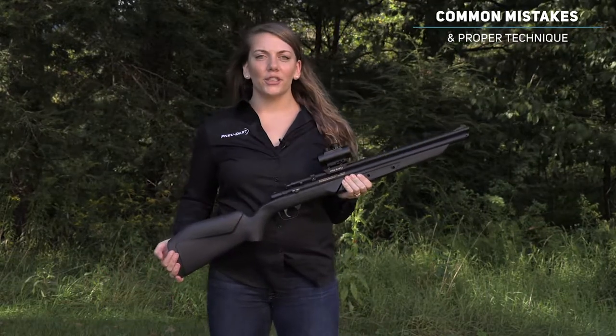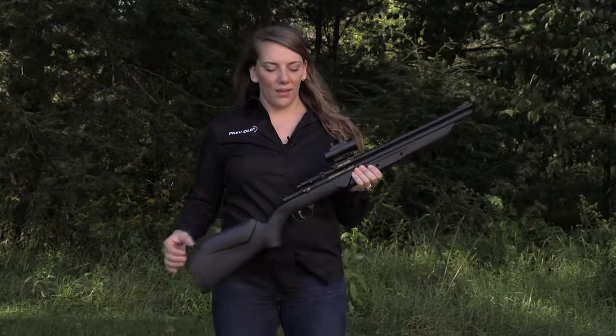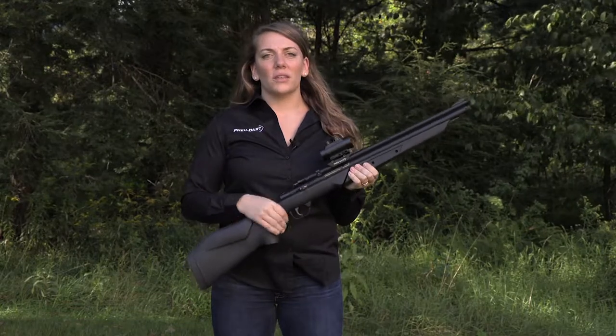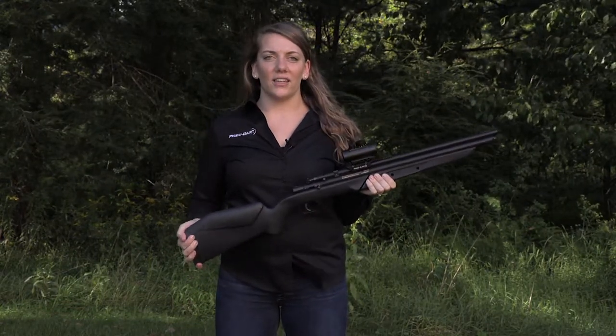Hi, I'm Samantha and I'm here to show you some common mistakes when pumping the 178B. Quick, half or three-quarter pumps will build inconsistent pressure which will lead to improper muzzle velocity when delivering your RDD to the intended target.